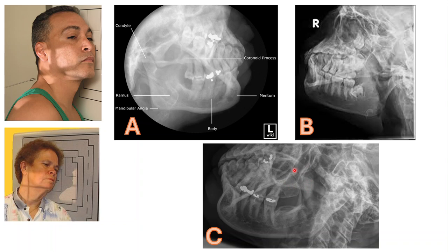They had that cephalad angulation to clear that superimposition, but at the same time, I'm coming over to the mandible of interest, following from the gonion up the ramus and the condyle, and I see that the C-spine is superimposing a lot of that anatomy that we want to see. This would be an example of insufficient extension of the neck. The C-spine is still superimposed on the anatomy of interest. I hope that this was helpful.